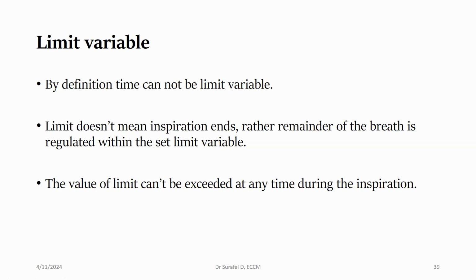It will deliver the volume of gas for that specified time. So time should not be a limit variable. Either use volume, flow, or pressure as a limit variable. Okay?